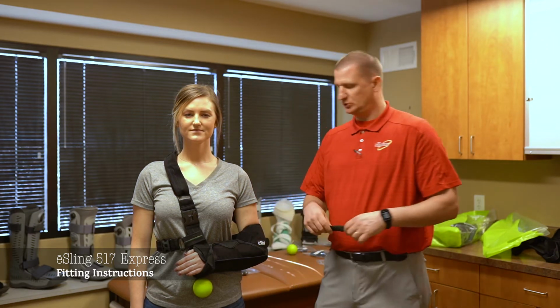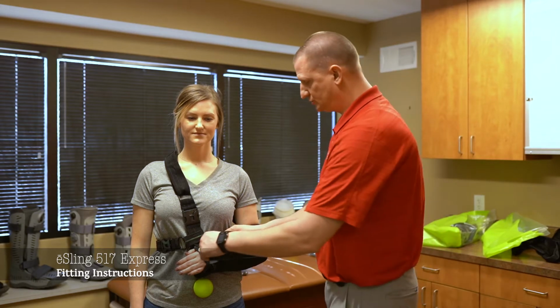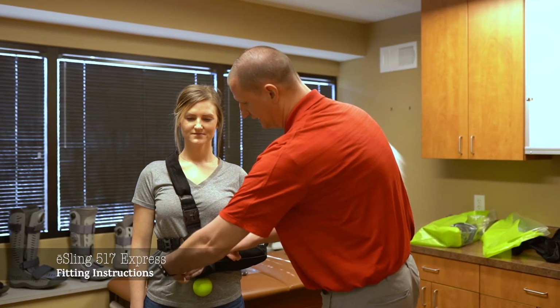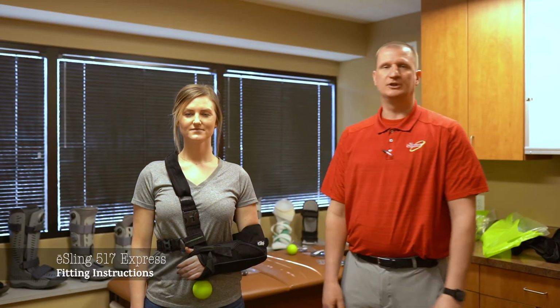Lastly, we have the optional thumb strap. This thumb strap goes in between the thumb here to keep the patient, again, from having any type of wrist drop, and keeps them secure, wrist straight within the cradle.